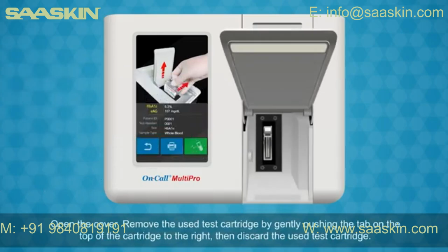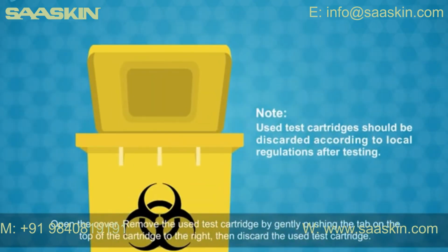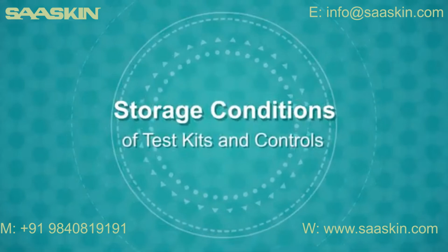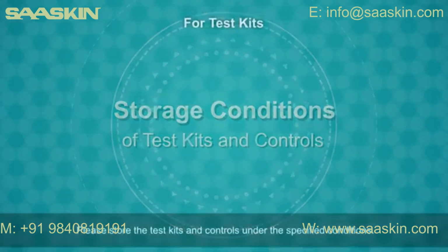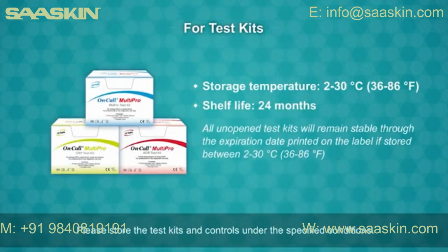Open the cover. Remove the used test cartridge by gently pushing the tab on the top of the cartridge to the right. Then discard the used test cartridge. Close the cover. Storage conditions of test kits and controls. Please store the test kits and controls under the specified conditions.